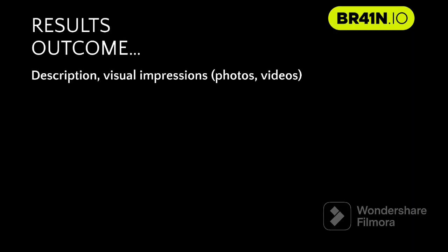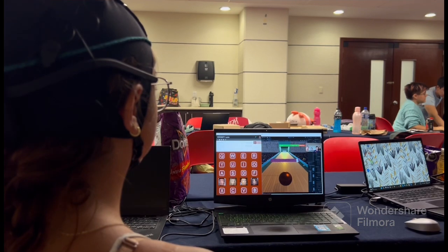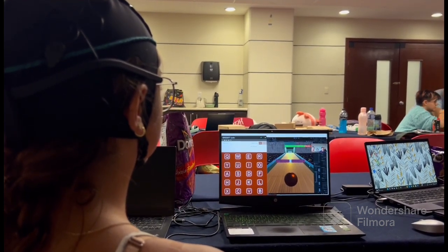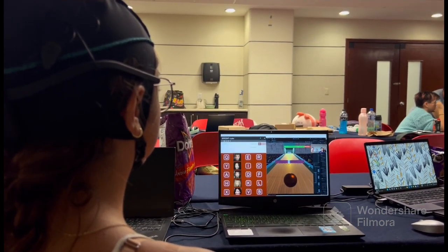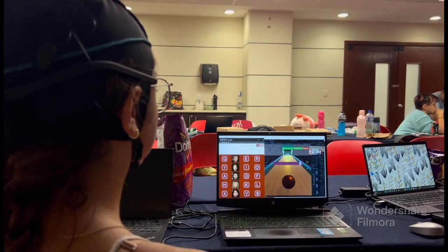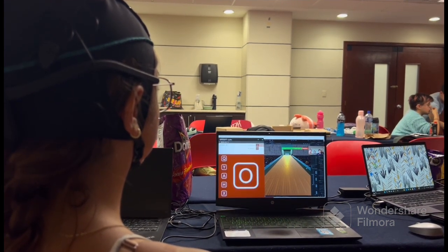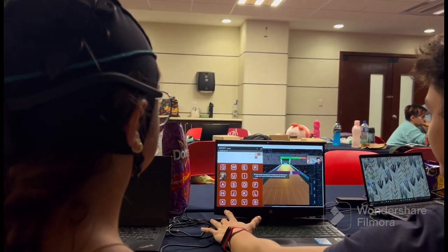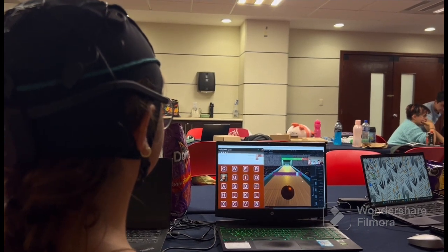In this live demonstration, we are showcasing the functionality of our program. Ana Laura is actively engaged in the process, directing her focus towards the letter O to initiate the motion of the bowling ball. Once activated, the program propels the ball forward, and the direction bar settings influence the trajectory that the ball follows. This interactive experience illustrates the integration of user focus, sensed by the Unicorn and registered by the speller, and the control within our application.